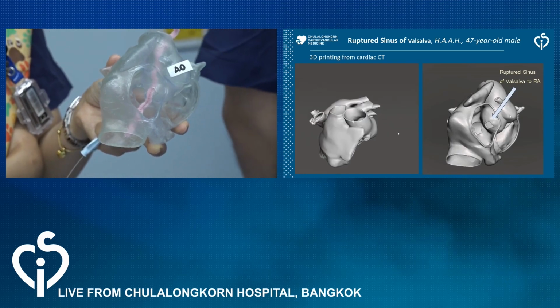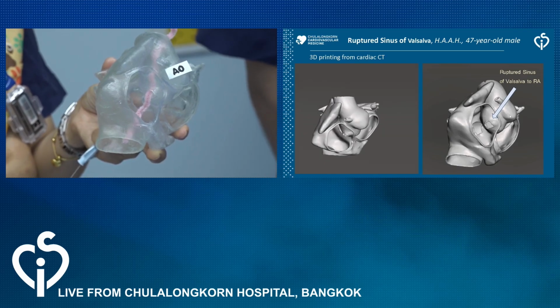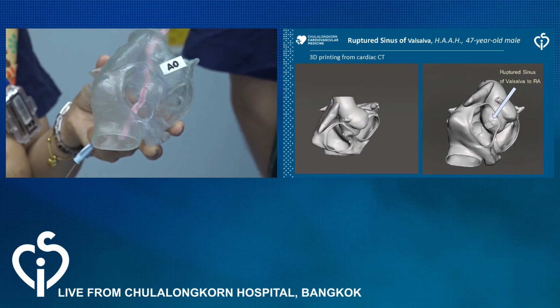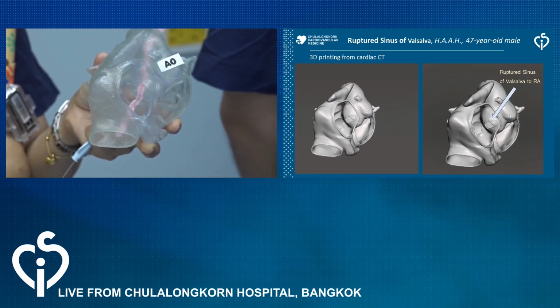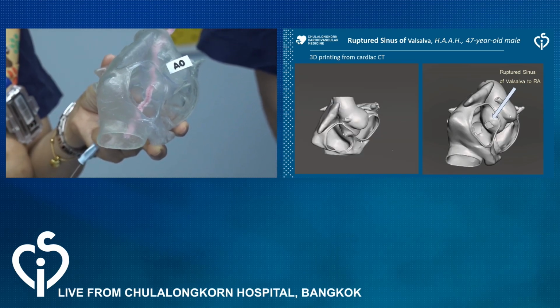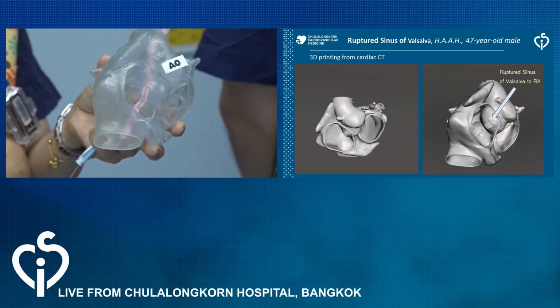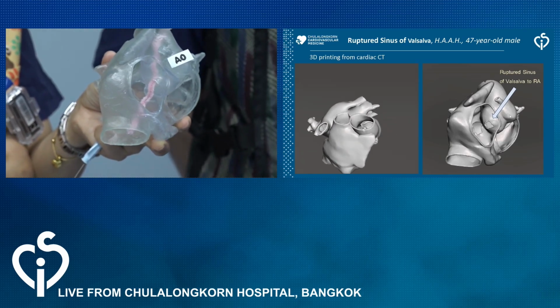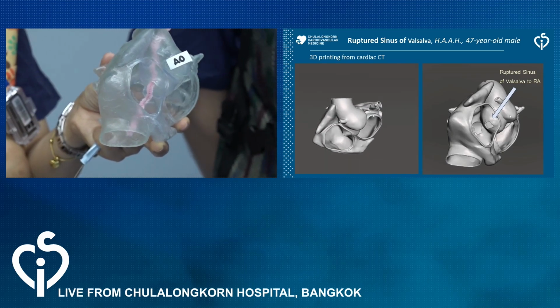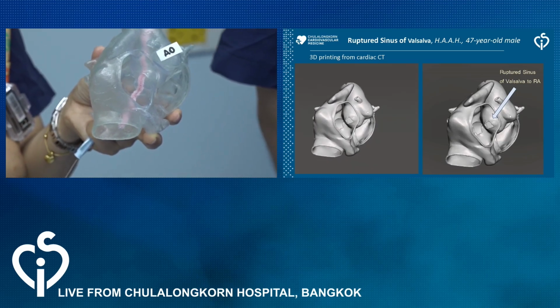Thanks for presenting the case. What I do not understand is this very bad left ventricular function in this patient. If you look at the echo, the long axis, that's a fraction of shortening of 15 or 20 by eyeballing, which is far too low. For me personally, the additional volume load does not explain this at all. And the pulmonary hypertension with a diastolic pulmonary arterial pressure of 26 or so indicates high capillary wedge pressure. So is there anything else other than this defect in this patient? Yes, we have to close the hole, that's a different story.